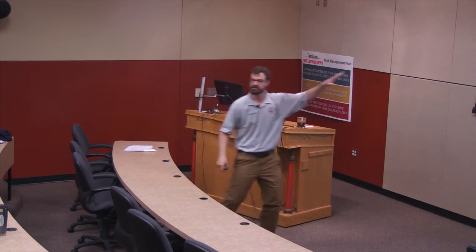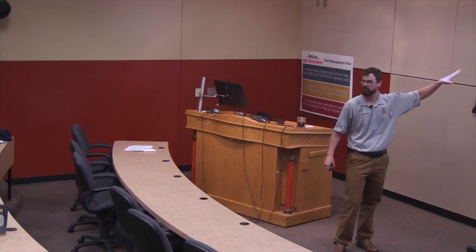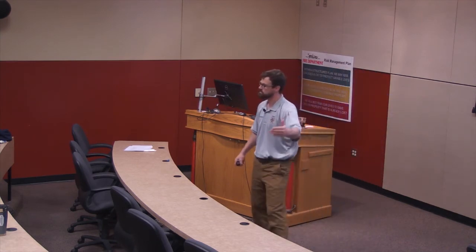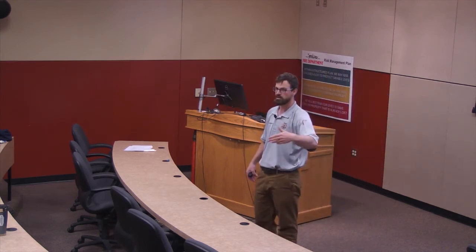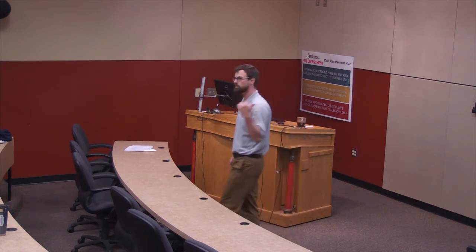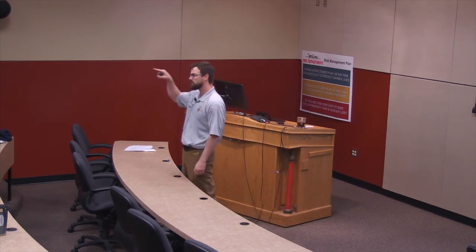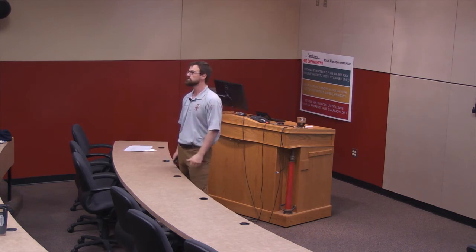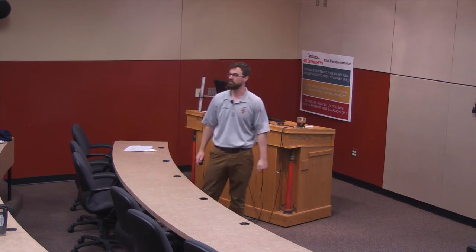So the anticipation of what could come down the pipe is what we're doing with the long QT. It's not that I'm going to do anything about it, like with a wide QRS where I'm going to treat with bicarb, but in this circumstance, I'm just telling myself, you know what? Something bad could happen. I've got a setup for it. I see the interval is off. This is how long QT happens. I'm going to be prepared for it. So when it happens, I was expecting it, not caught off guard by it.